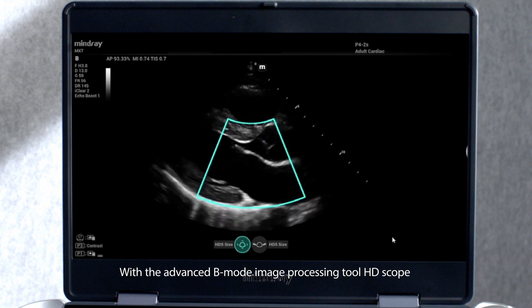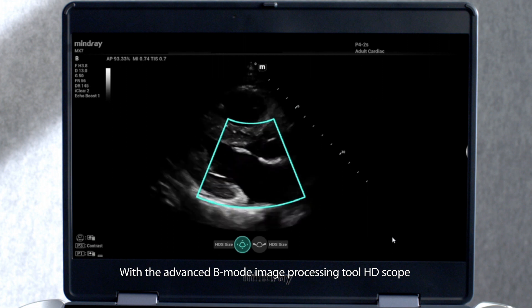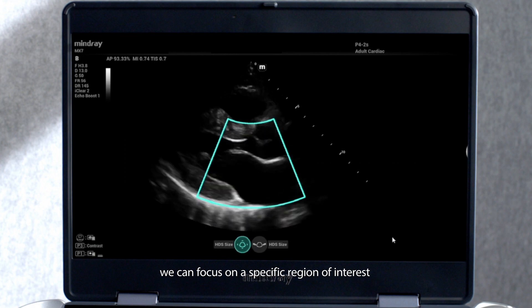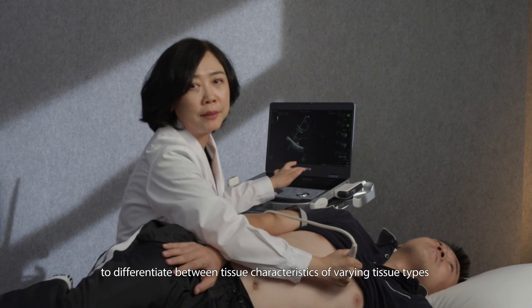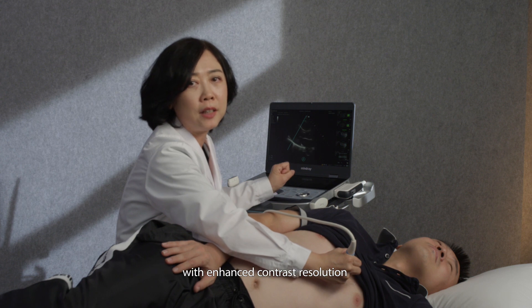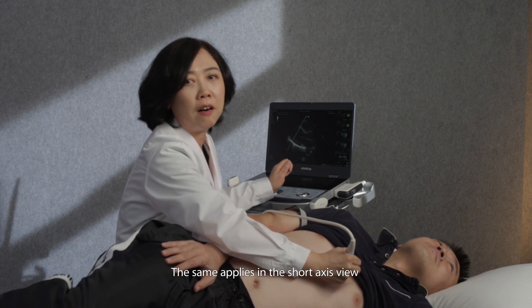With the advanced B-mode image processing tool HD-scope, we can focus on a specific region of interest to differentiate between tissue characteristics of varying tissue types with enhanced contrast resolution. The same applies in the short axis view.